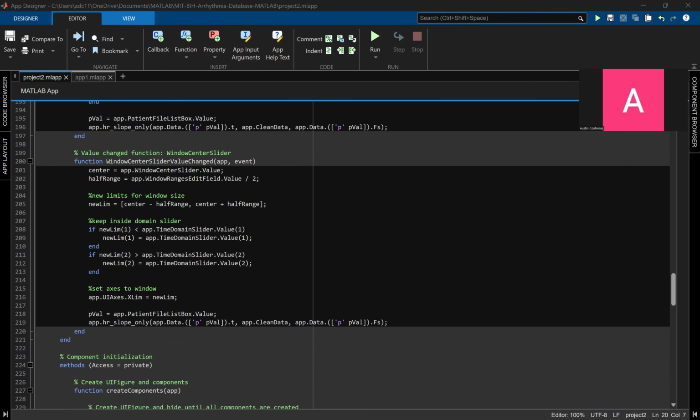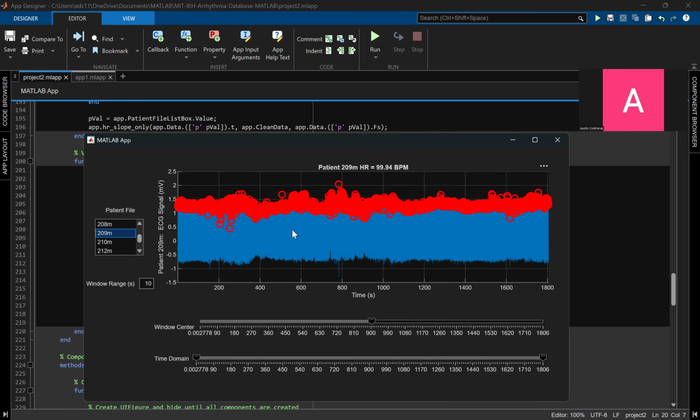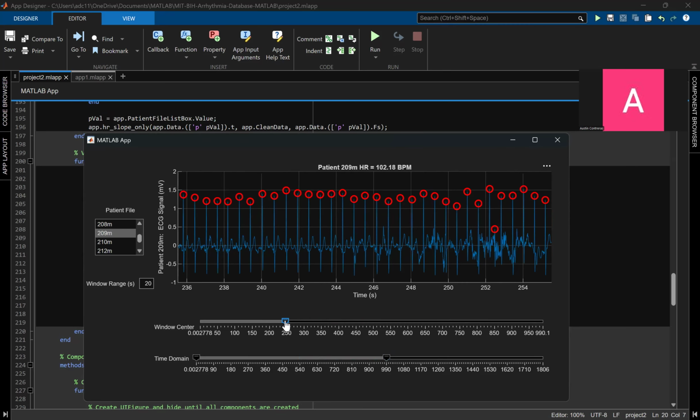And then actually running it, we can just pick a patient, and it'll start with the entire data set, and then we can shorten the time domain we're looking at, which will adjust the heart rate, and then we can select a small window within this data set, which can be 10 seconds, or we can change this to 20 seconds, and then pick a larger window, and then choose that smaller window.